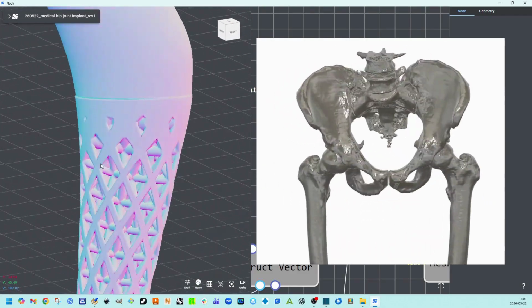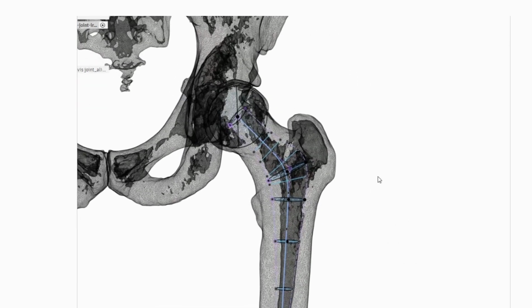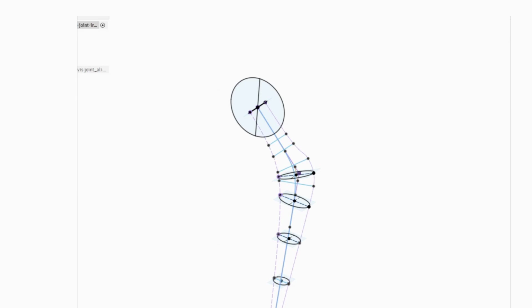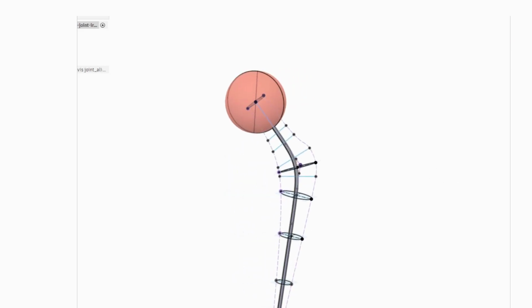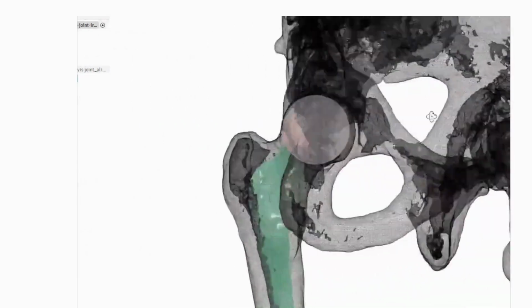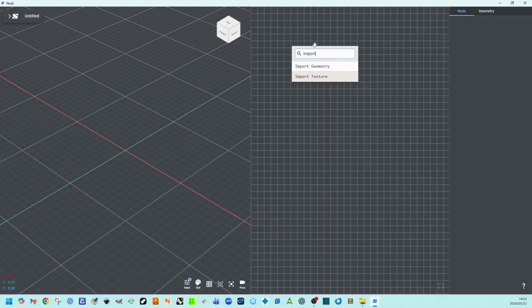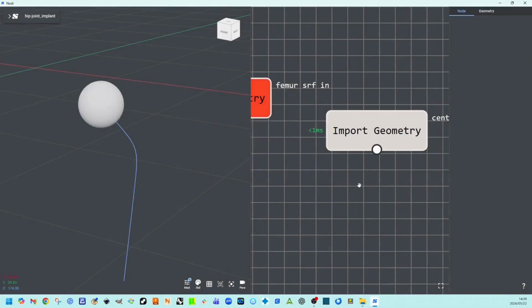In this tutorial, we'll model a parametric hip joint implant in Nodi. First, in an external CAD tool, we build the loft form that matches the actual bone data. To start, we drop an import geometry node and load the femur surface mesh.